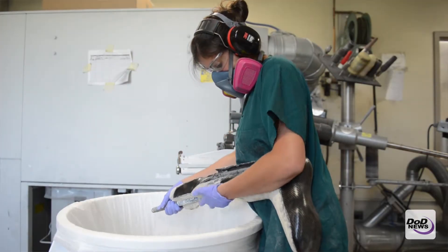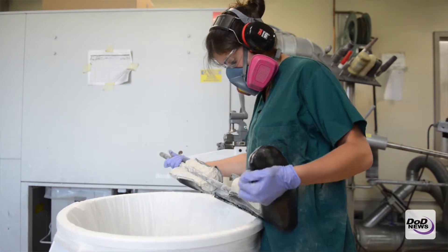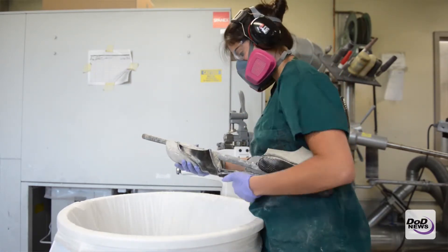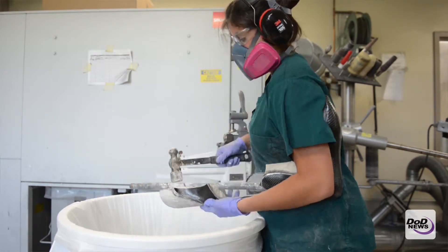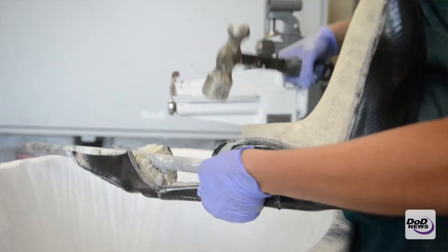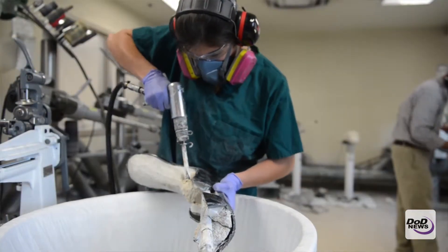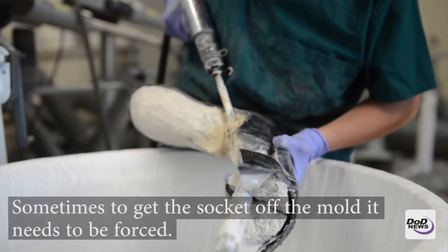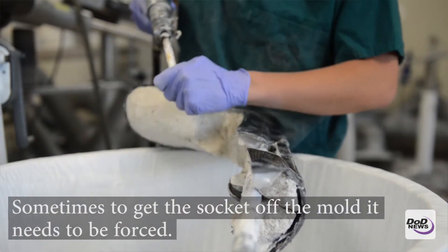Sometimes to get the socket off the mold, you will have to hammer and pound the socket off of the mold itself. If the shape is a little bulbous or a little irregular, it may be hard to take off, so we use air compressors to help take off the socket along with hammering and pounding.